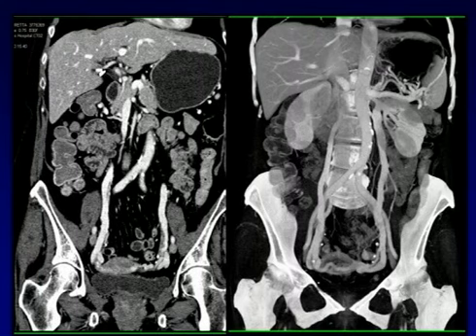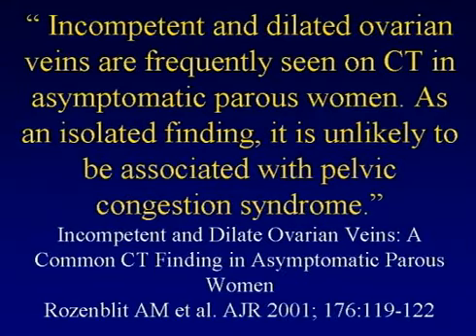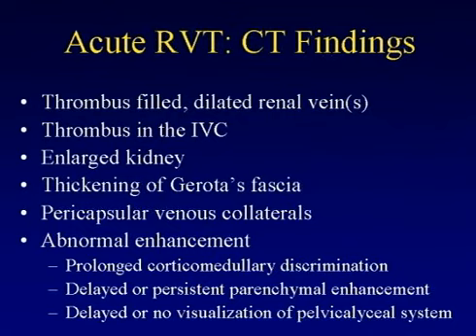There have been several articles in renal donors looking at the importance of the gonadal veins. Most of the articles will conclude that it's just an isolated finding, as in this article, though others have concluded that it can be very important, that in retrospect, patients after they donated a kidney actually recognized that they had prior symptoms which had disappeared. So there's some controversy, but most of the time it's just simply an incidental finding.